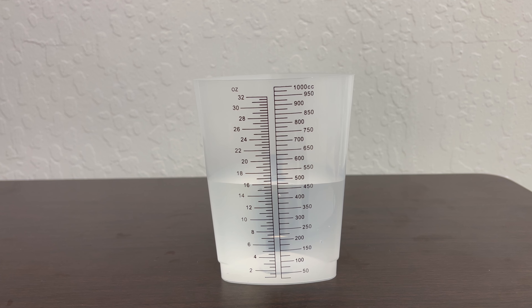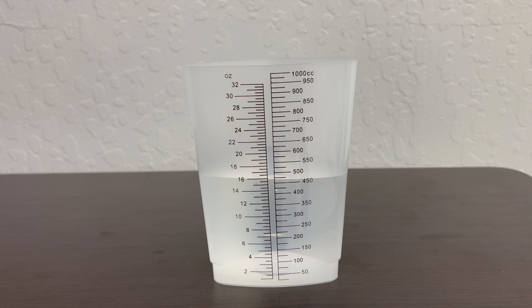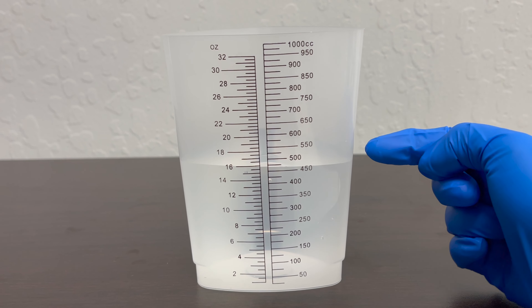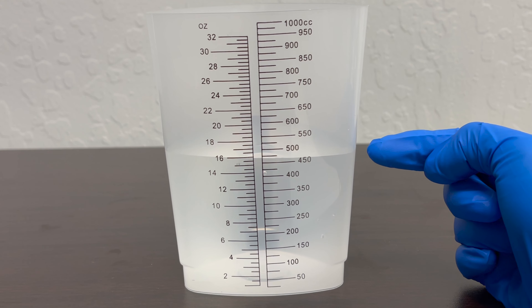The next step is to measure the amount of urine at eye level with the container on a flat surface. If it's between measurement lines, you can round up to the nearest 25 milliliters. So if we're looking at this at eye level, this is about 475 milliliters.